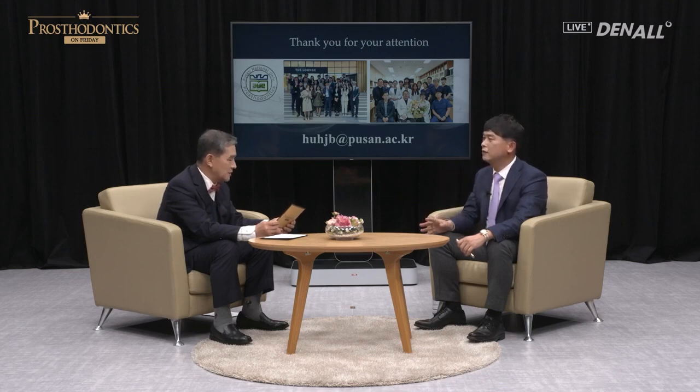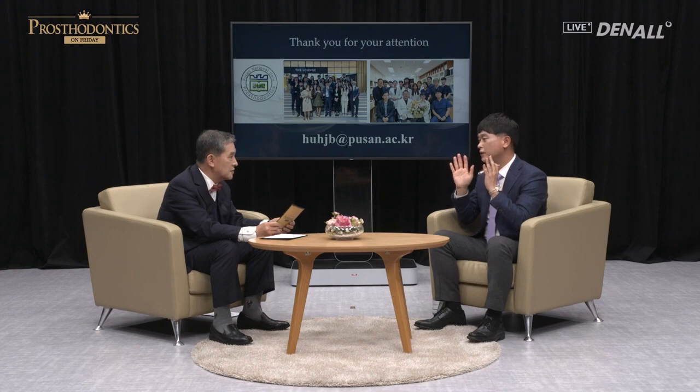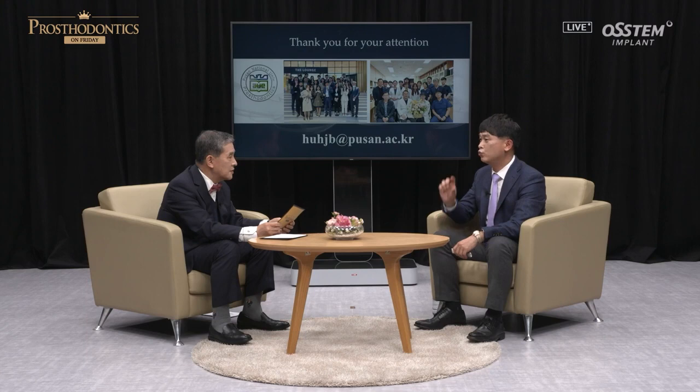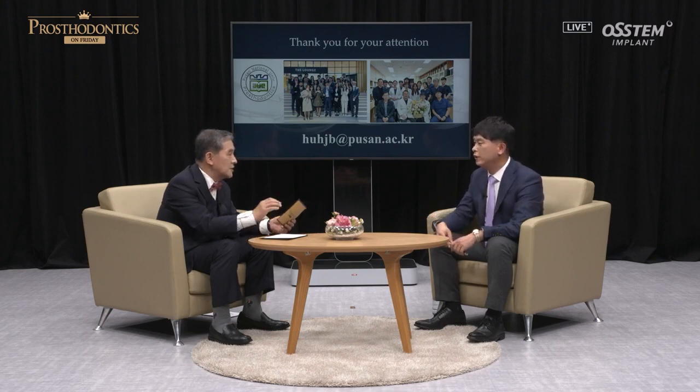Zirconia is very brittle. When you drop it, it breaks. I recommend that it is used for partial rather than full. When I use it for the full case, I train or instruct the patient not to remove it in the bathroom vanity without covering it with a towel. I tell them to remove it on the bed. One of my patients actually removed it on the vanity and dropped it, and it broke into pieces. Even though it is thick, it can break.